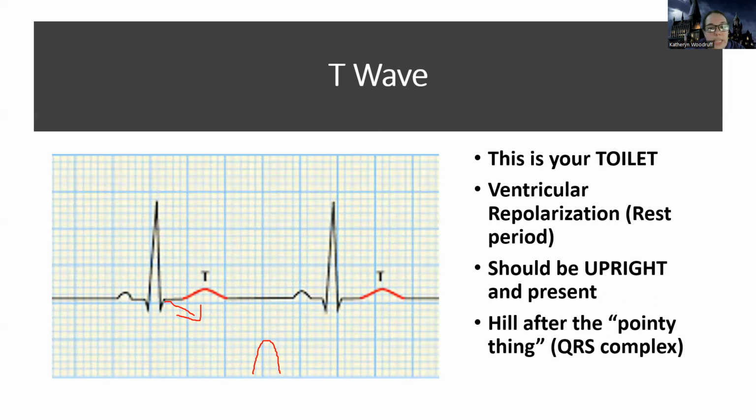Now we're not going to get too in depth with the T wave. Since we don't talk about heart attacks, we're not expecting you to know a lot about the ST segment, ST elevation and ST depression, inverted T waves or peaked T waves. We do want you to understand hyperkalemia. So the only thing I could think we could test you over is this peaked T wave, which can be a sign of high potassium.